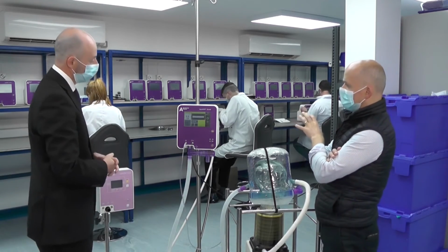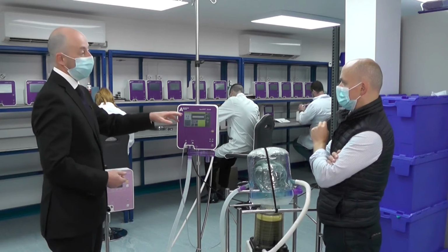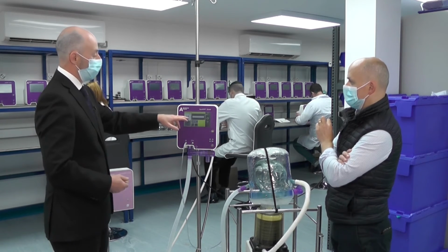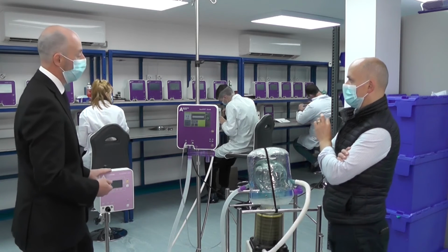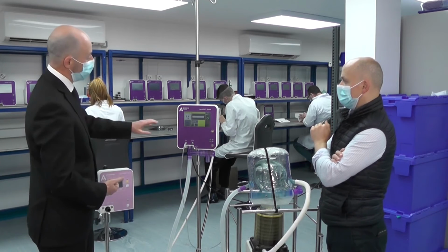How have the adjustments changed between the FD140 and the FD140i? So the FD140 is a very basic device. It's intended just for basic CPAP. There are a number of significant clinical enhancements, one of which is the pressure trace. The pressure trace is sensitive to 0.1 decimal place. In the FD140, it just gives you a simple 1, 2, 3, 4, 5 centimeters of water pressure.